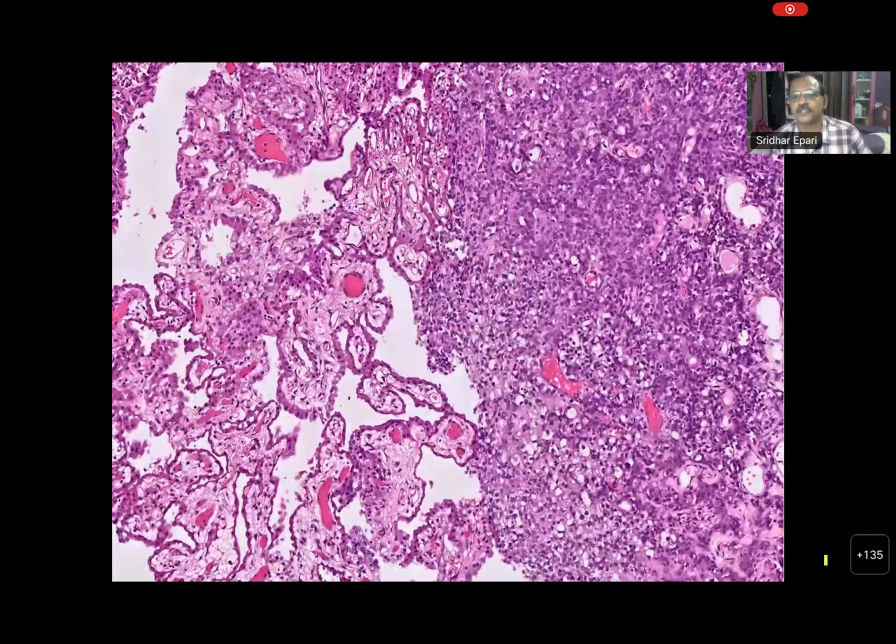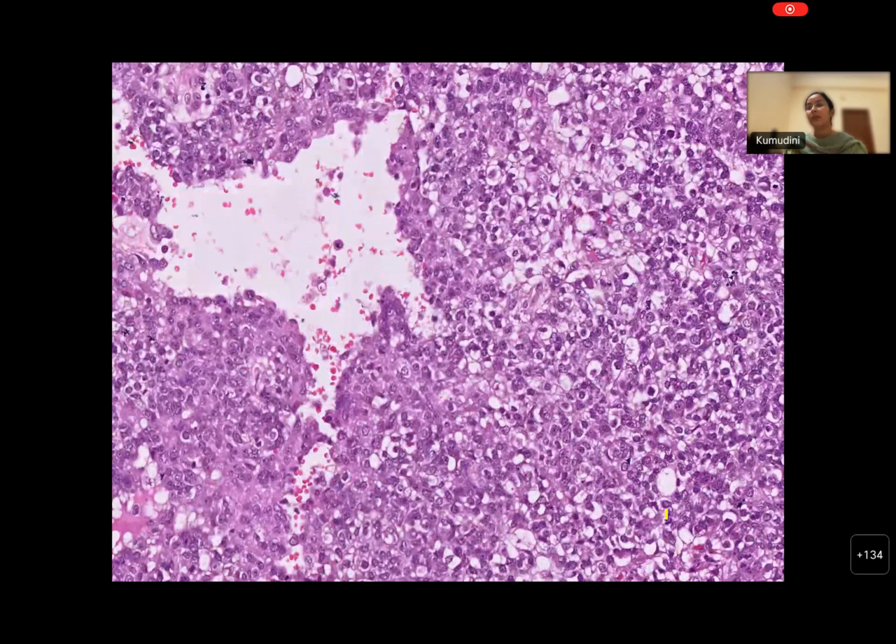Histology is this. You describe this slide. Sir, in this image, one part is showing a normal choroid plexus lining, separate from the fourth ventricular side. The other part shows a tumor with densely packed tumor cells of variable sizes.